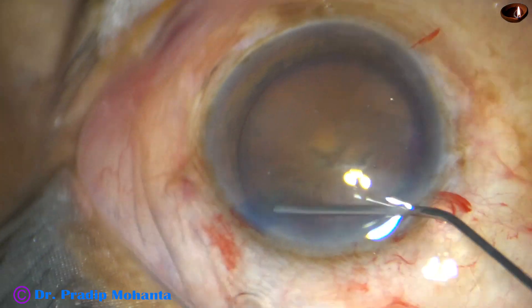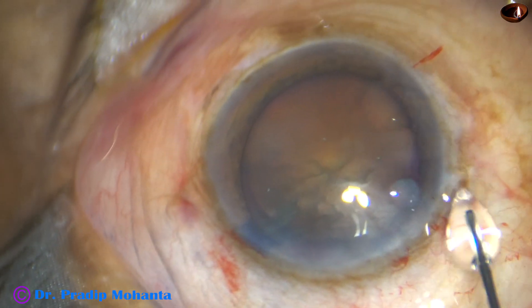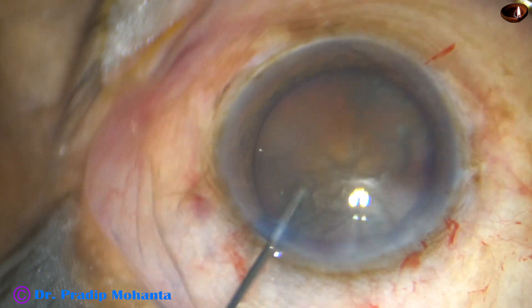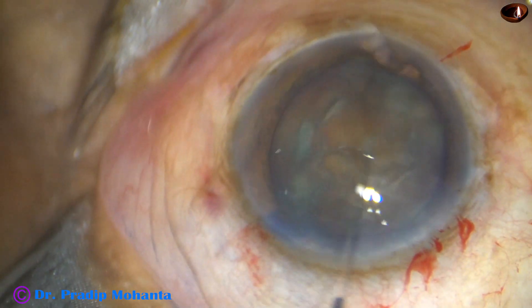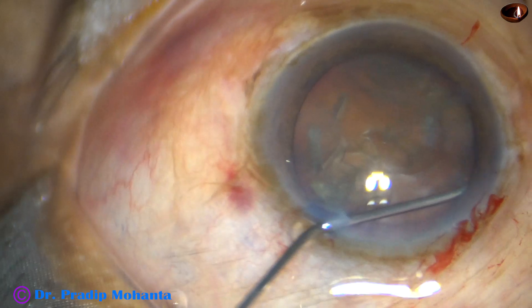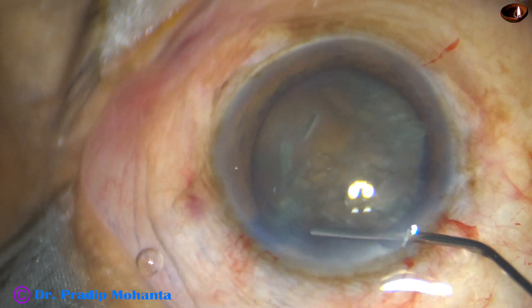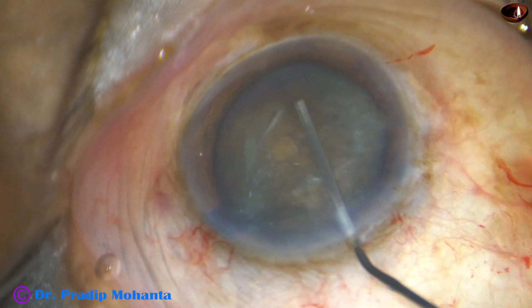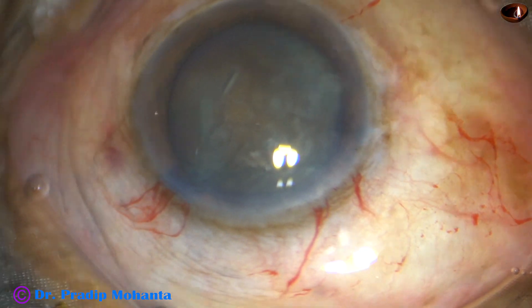And now, this is hydrodissection, being done at multiple points. The nucleus is mobilized, but it didn't rotate freely. So I am doing some more hydro — another injection. I have applied BSS at about 4 points.